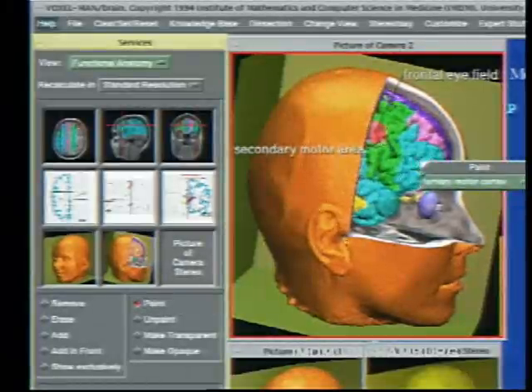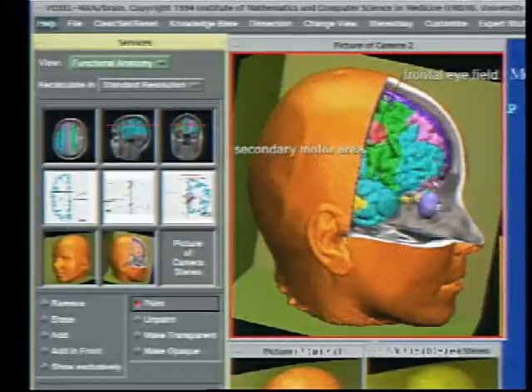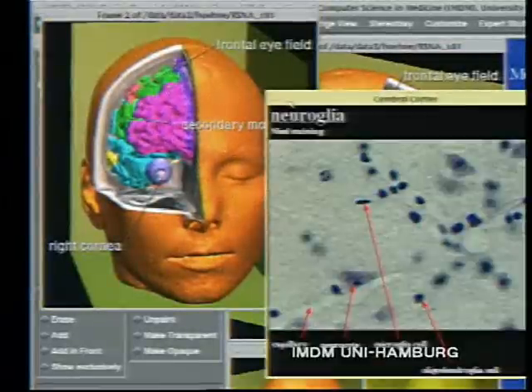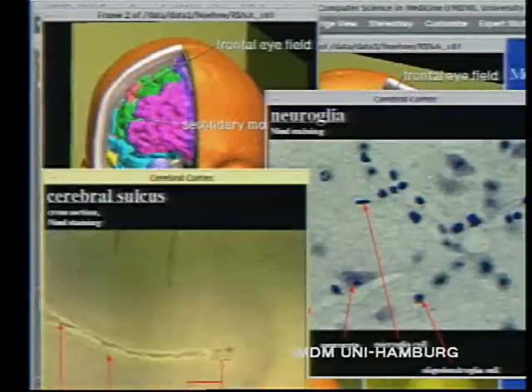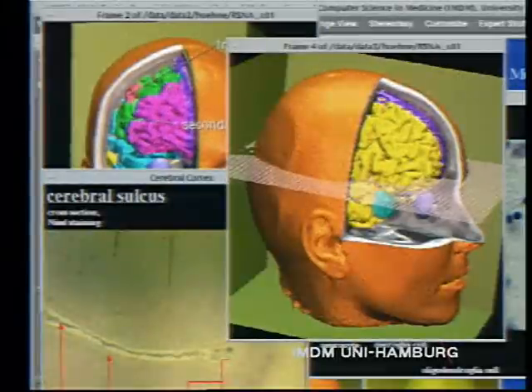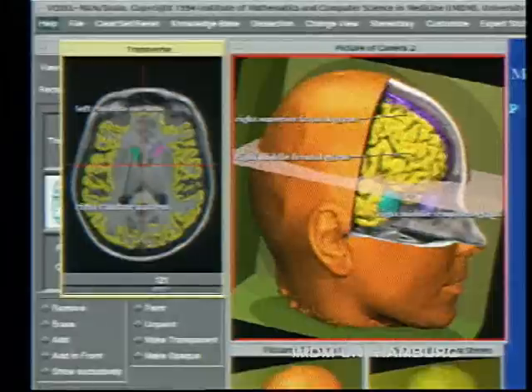This short clip shows only a few of Voxel Man's capabilities. Of course, the model can be viewed from any direction. Sample histological images may be called up and so on.